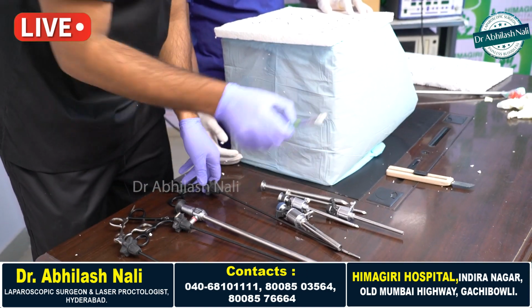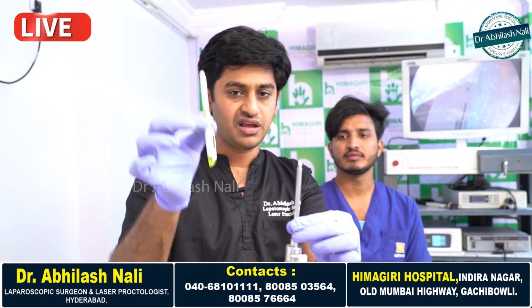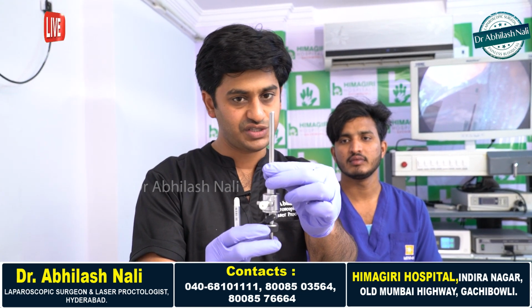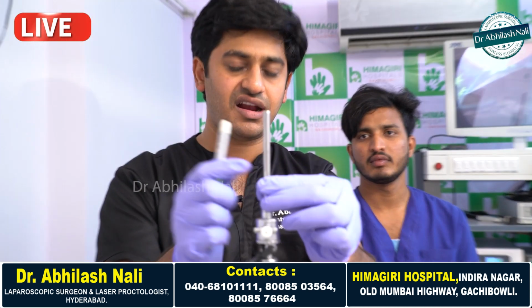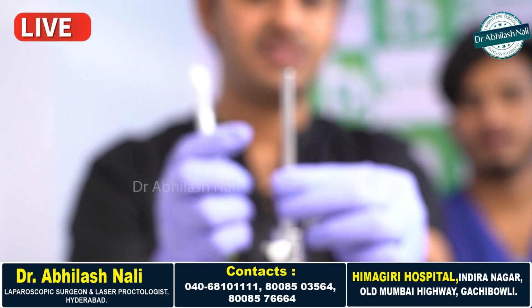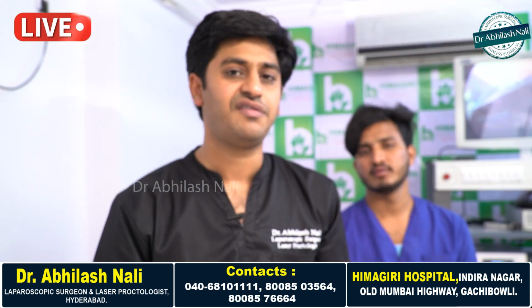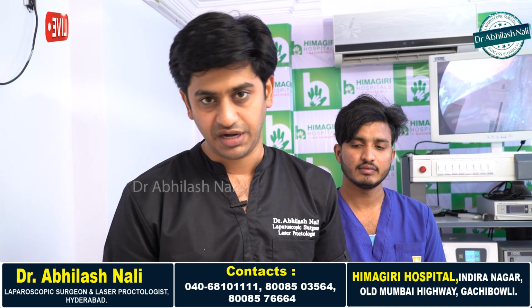And how large will these instruments be? If you look at a side-by-side comparison, this is a normally used pen, and this is one of the laparoscopic instruments which we generally use. If you look at the diameter of the pen and the diameter of the laparoscopic instruments, this is much thinner than the normally used pen, and the incision you will be left with after a laparoscopic surgery may vary from 0.5 to 1 centimeter only.